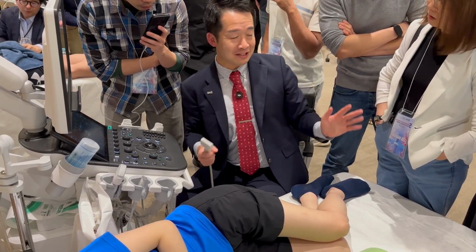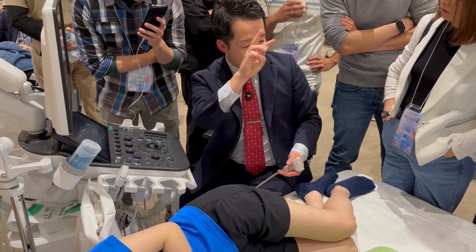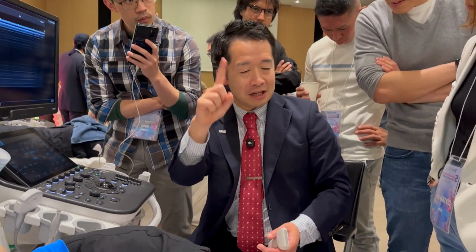All right, so that's the basics. Patella tendon, IT band, lateral meniscus, LCL, and appreciation for the tibial arm of the biceps femoris. Let's do that.